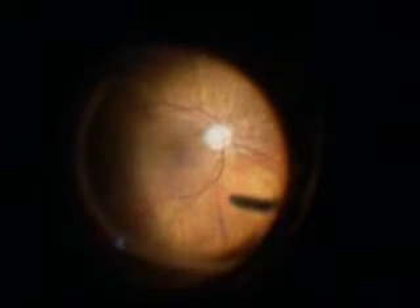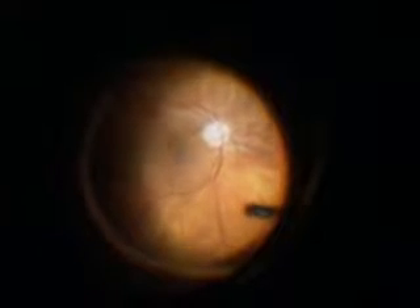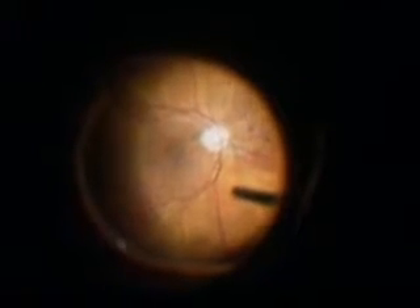Macular hole surgery begins with removing the vitreous jelly. The jelly is stained with triamcinolone, which is a steroid, and this allows us to identify the back surface of the vitreous to remove it from its macular surface.